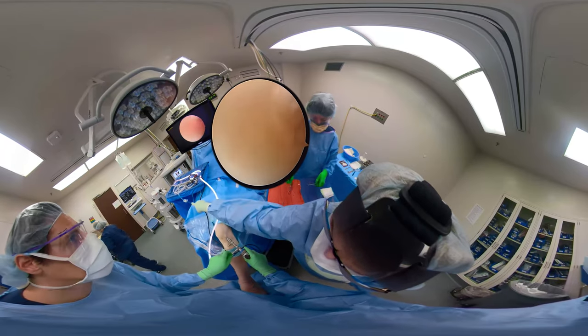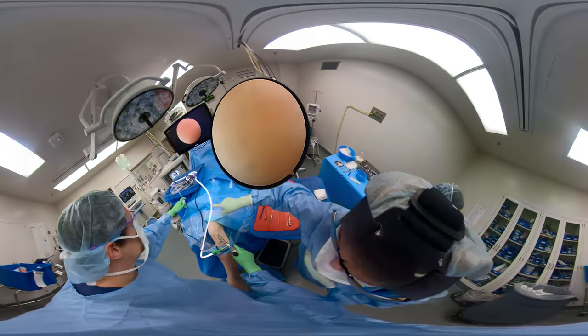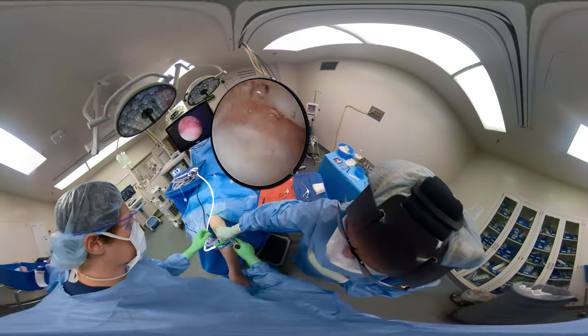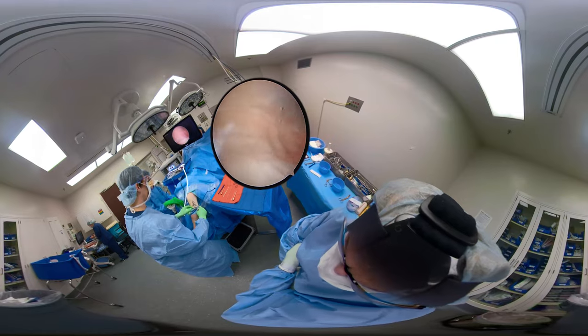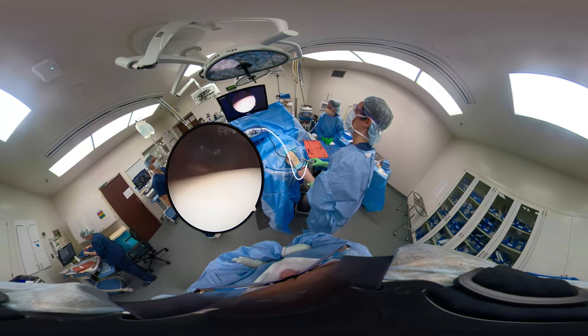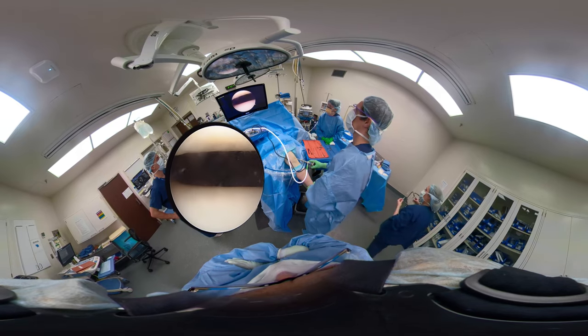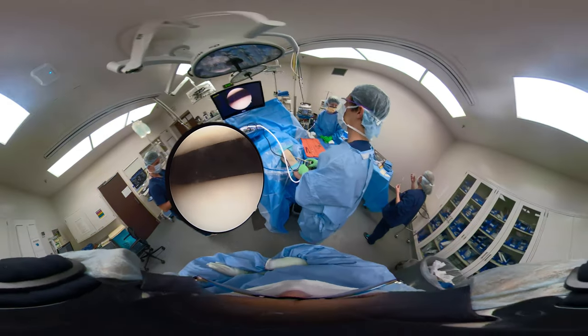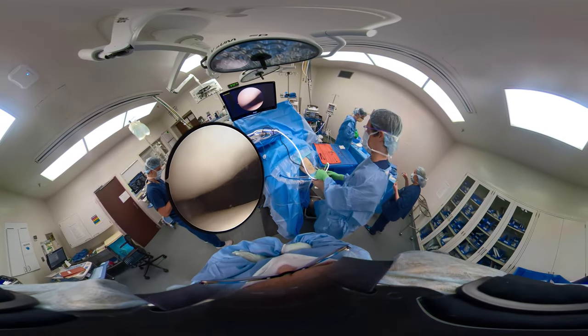Buttons are up. Lateral femoral condyle is up. Got to turn the water on to be able to see — you can see there's no view there, and then you can see the water coming in. We like to have bled that so there are no bubbles. You can see the position of the leg; he has the leg on his upper thigh, holding the scope with one hand. You really need to manipulate the light cord with one hand as well.